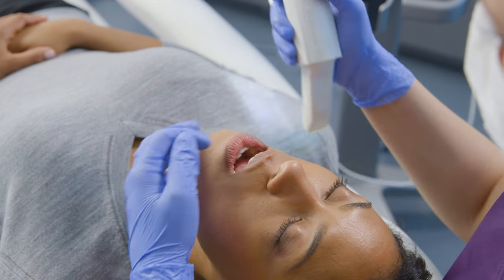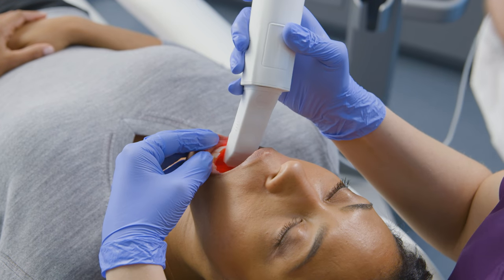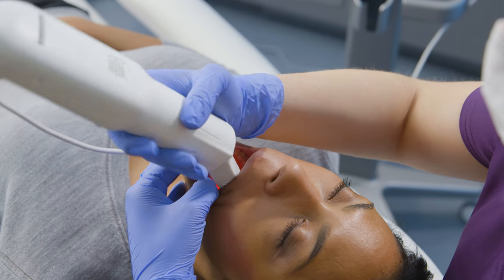When I transition to the lingual, I bring the cord end of the wand out to the side. Then, in a smooth motion, I bring the wand around the arch, keeping the wand tip tilted towards and facing the anatomy I am scanning.